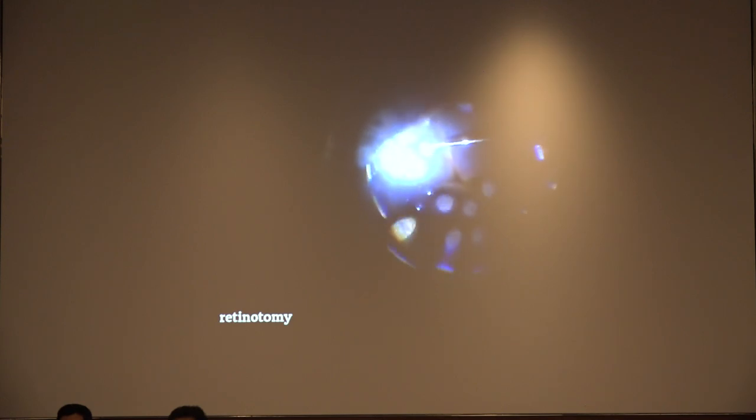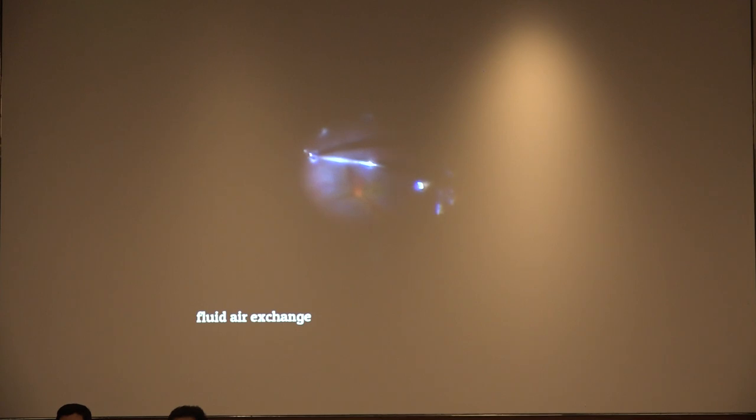And then, obviously, you need to do fluid air exchange. And the retina seemed to settle well. And finally, of course, you need to do, as we all know, endo laser.